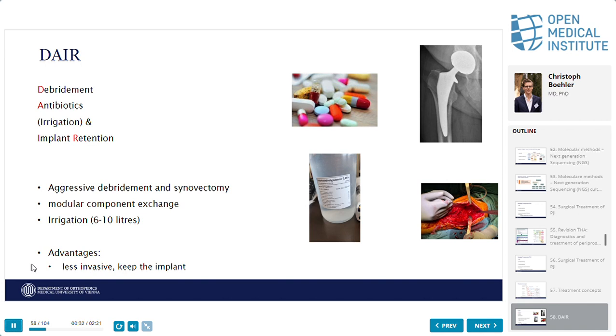Yeah, you keep it. And what about an uncemented stem, if you do it there after 1 week? Is it fixed or not? So you change it? You keep it? So we would get it out. It's not integrated, so we would get it out. Okay? Remove the stem. We remove the stem.